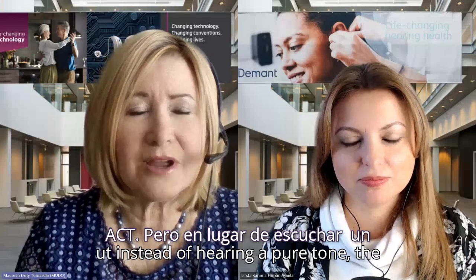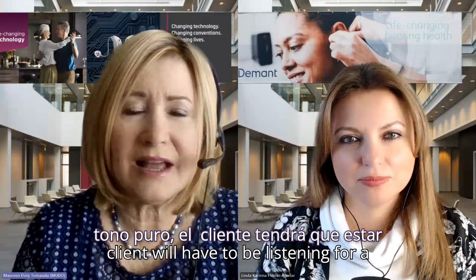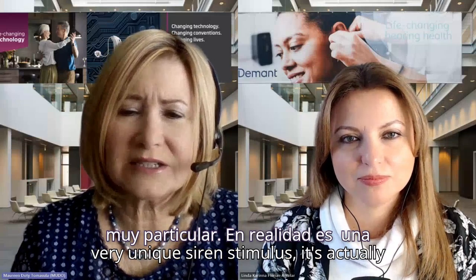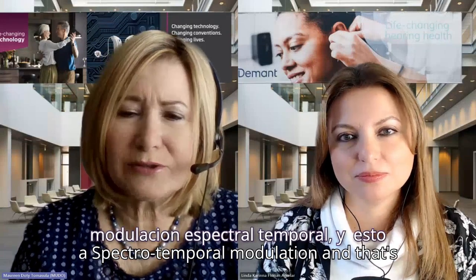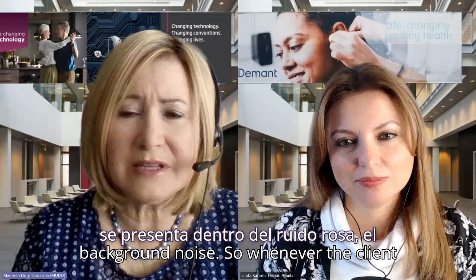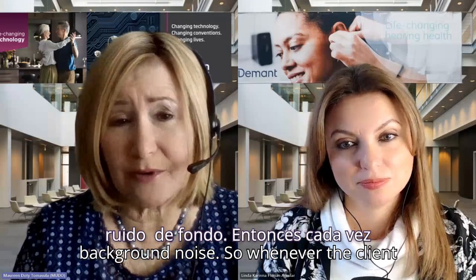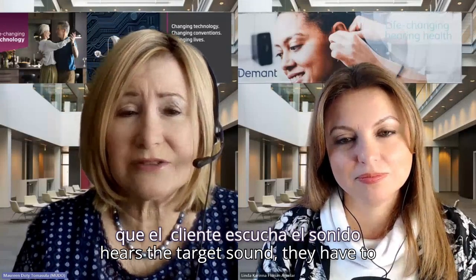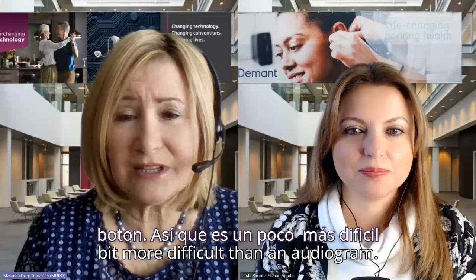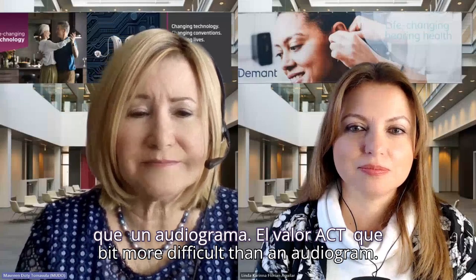But instead of hearing a pure tone, the client will have to be listening for a very unique siren stimulus. It's actually a spectrotemporal modulation, and that's presented inside of pink noise. It's the background noise. So whenever the client hears the target sound, they have to press the button. So it's a little bit more difficult than an audiogram.